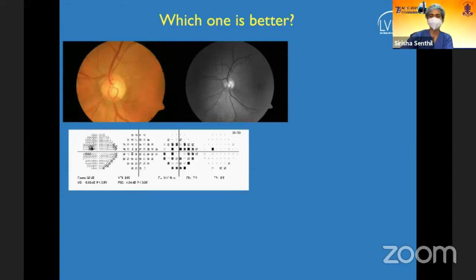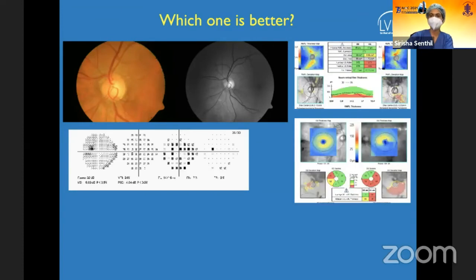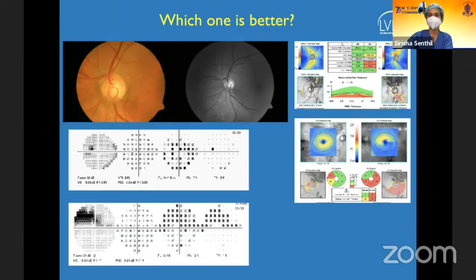Here is a patient with glaucoma showing an inferior NFL defect and disc near-notching, with essentially normal visual fields. OCT picks it up by both RNFL and macular ganglion cell complex analysis. Importantly, performing a 10-2 visual field — or using the newer 24-2C — revealed a paracentral defect, reclassifying this as perimetric rather than pre-perimetric glaucoma.